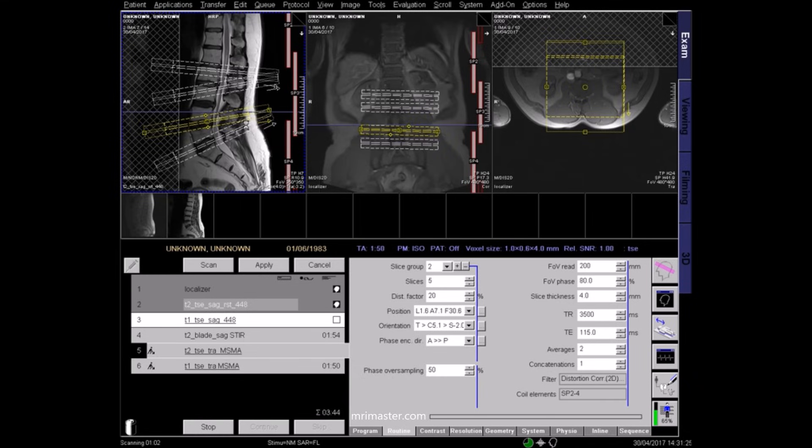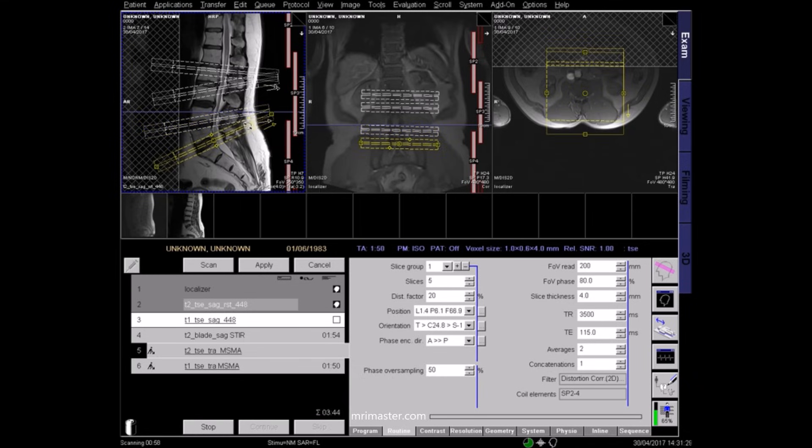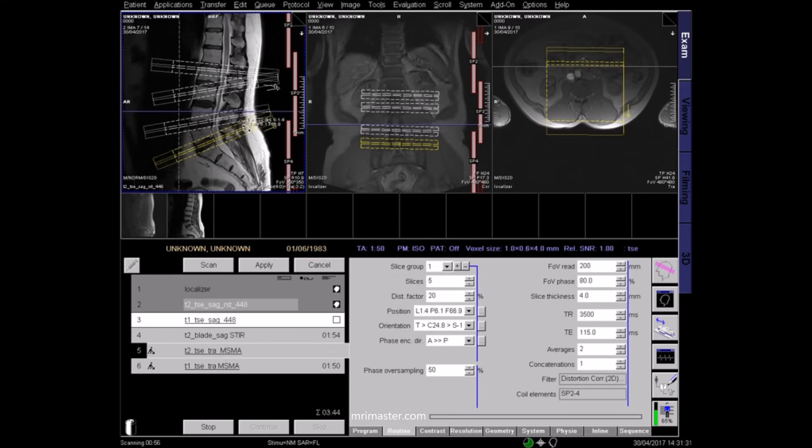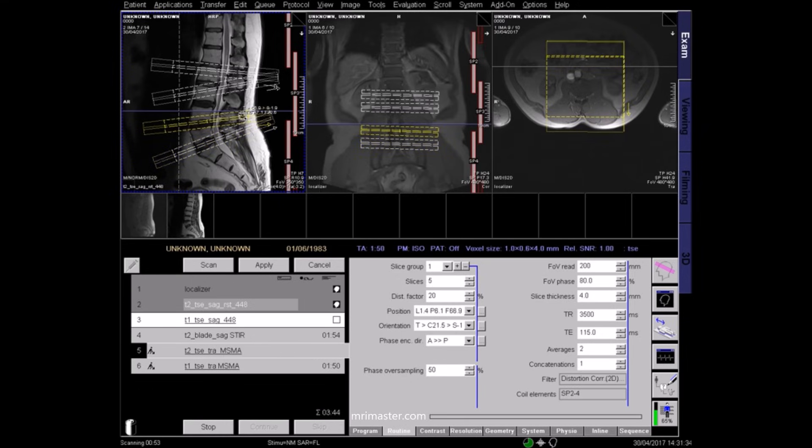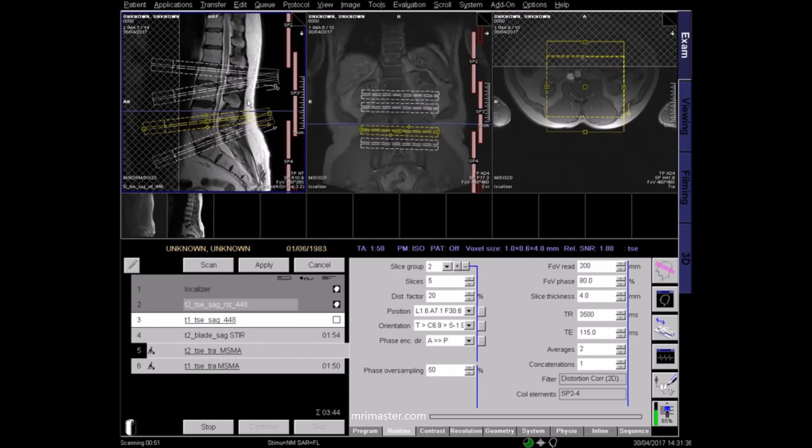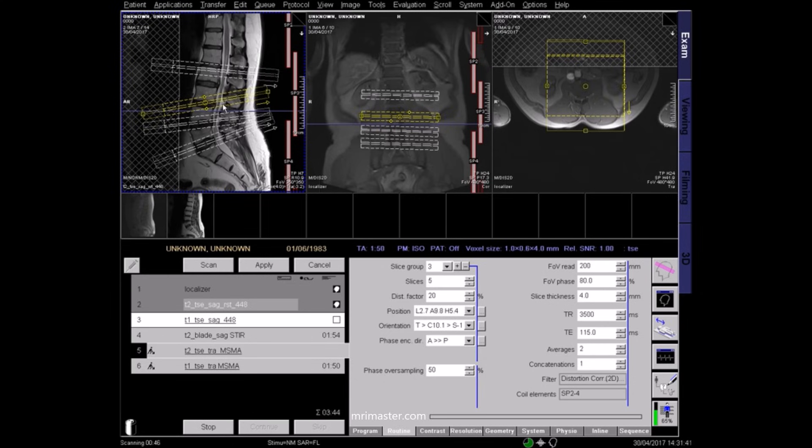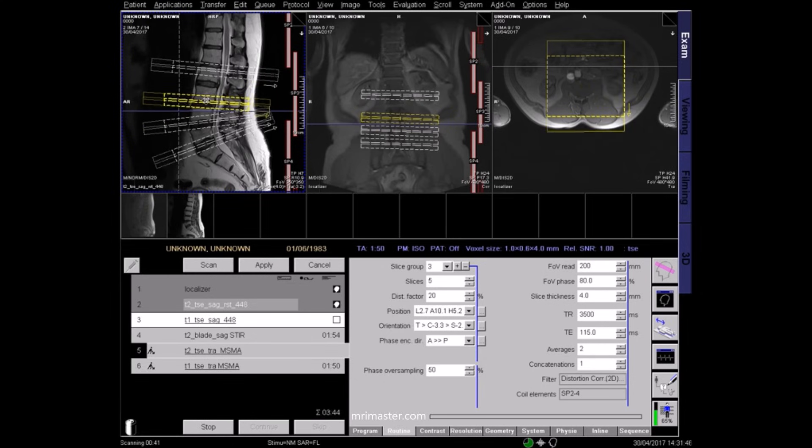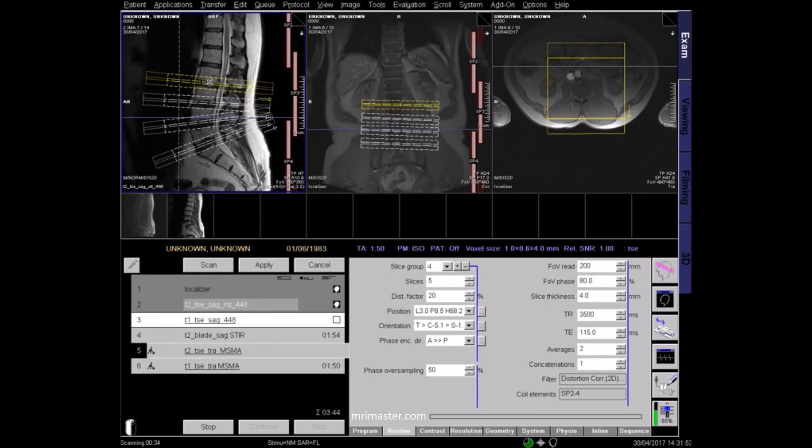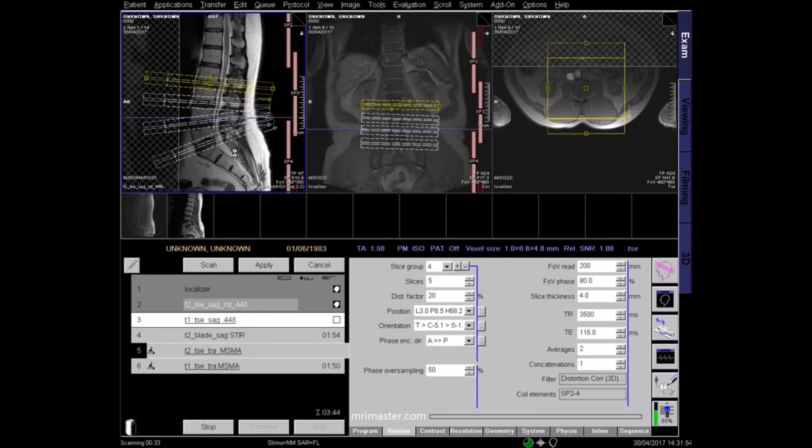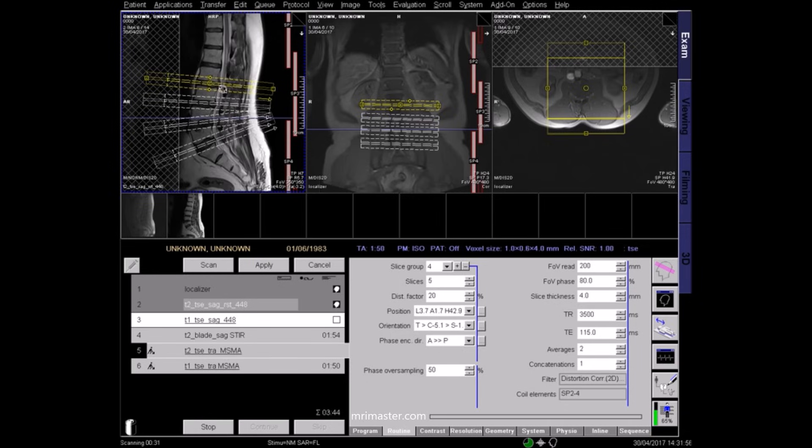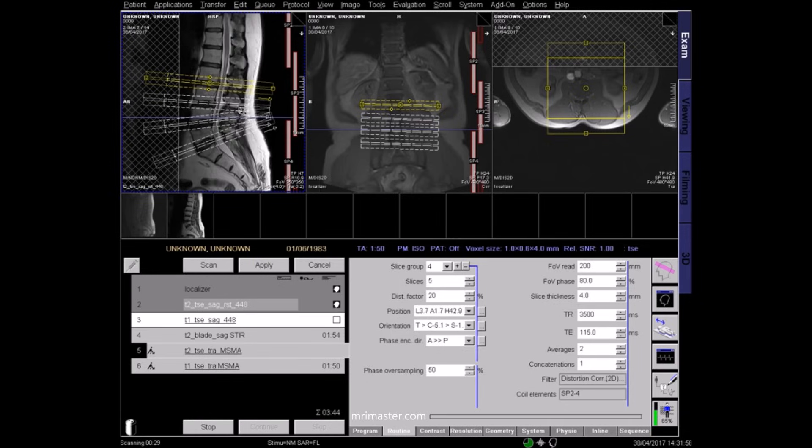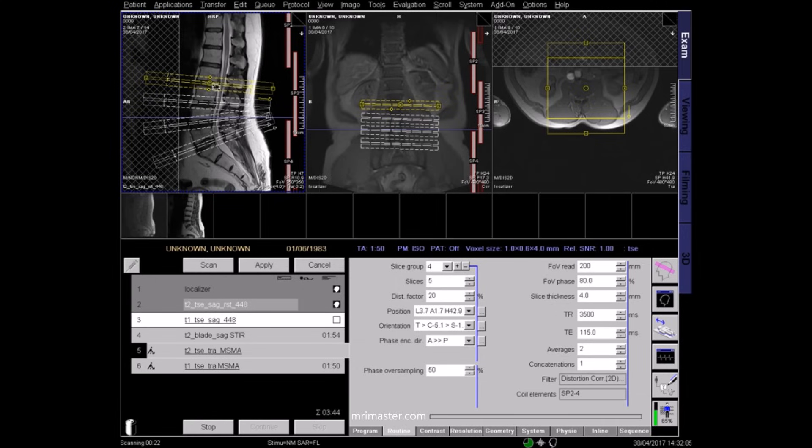Cover the last four intervertebral discs and any others that appear abnormal or prolapsed. You should also cover any other pathology that's seen in the vertebra or spinal canal by adding slices. Scroll through the image to ensure slices are sufficient to cover each intervertebral disc from top to bottom. A group of five slices is usually sufficient.